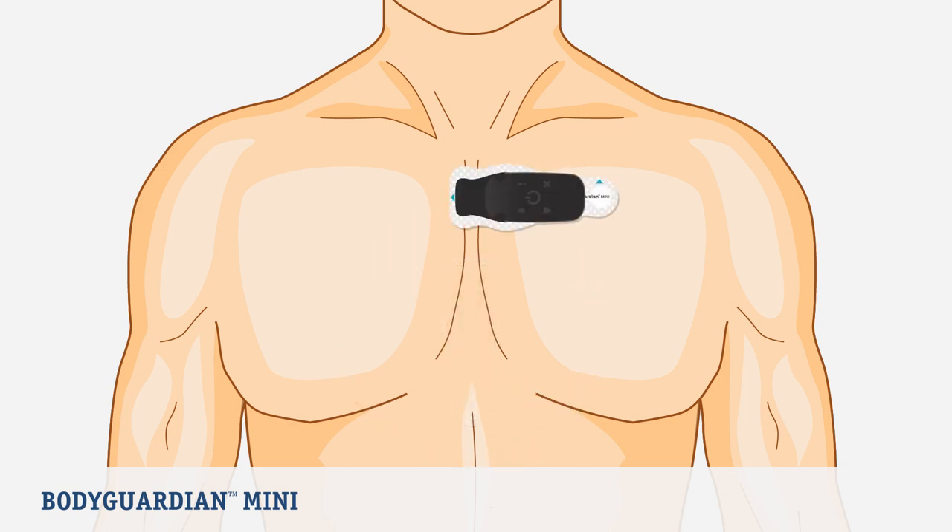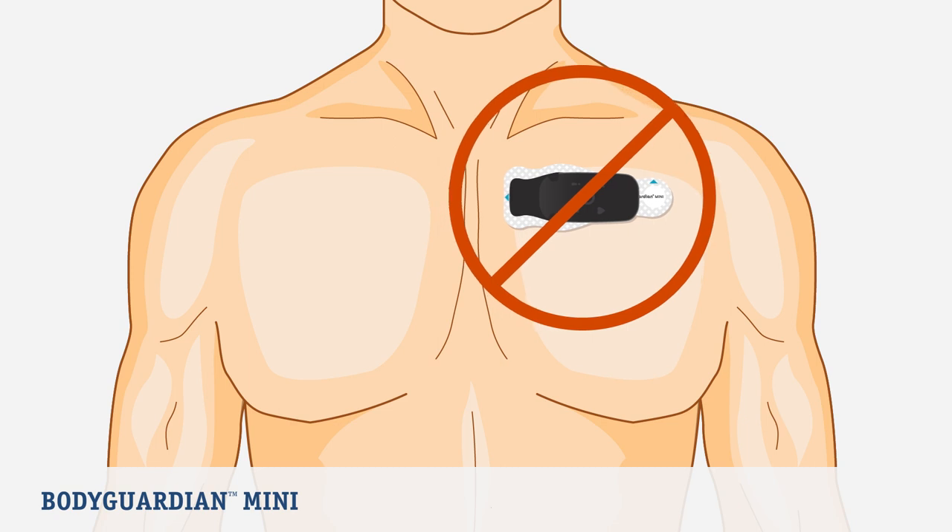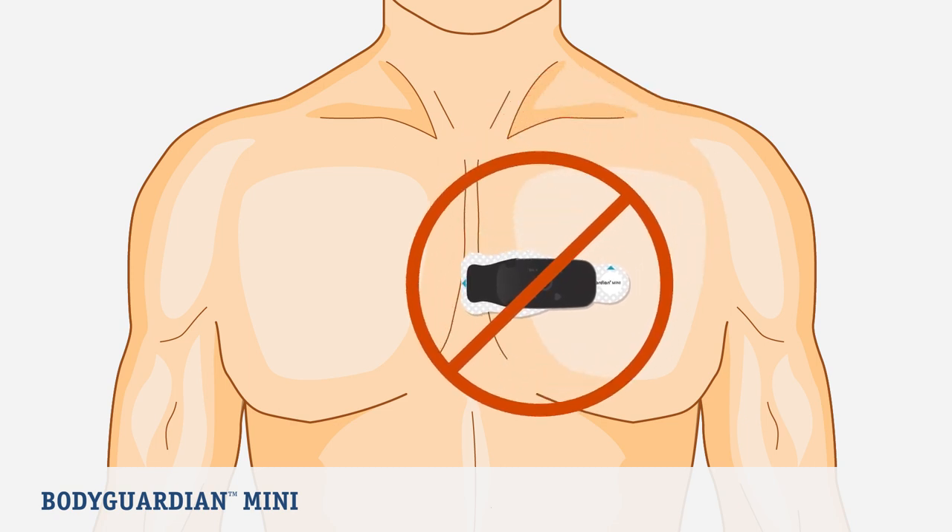If you select the horizontal placement, place the right side of the strip near the center of the chest over the sternum. Ensure the arrow on the strip over your left chest, near your left arm, is pointing up. Do not place the strip too far to the left or too low.